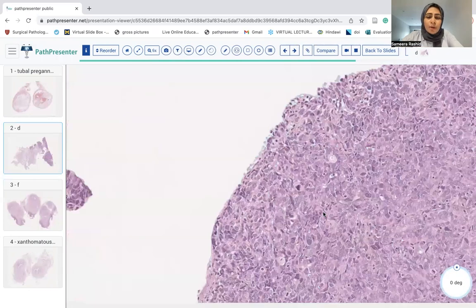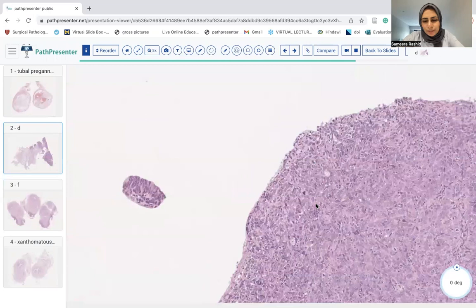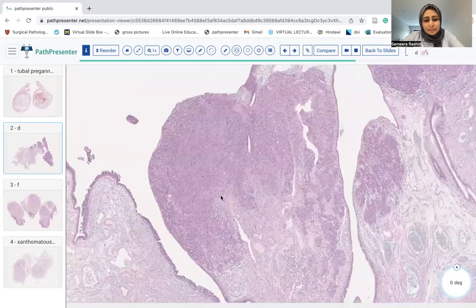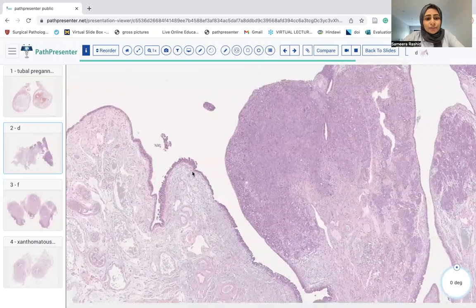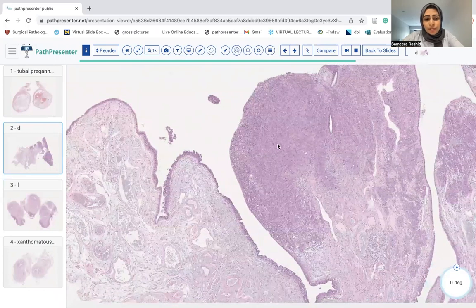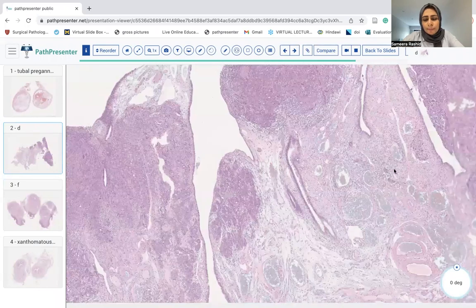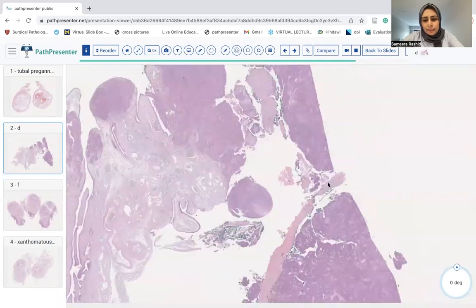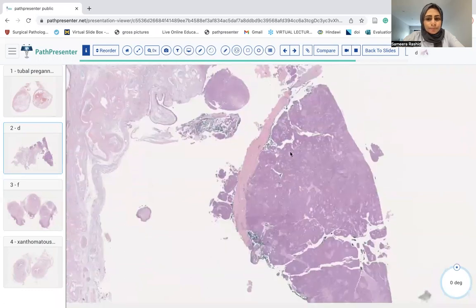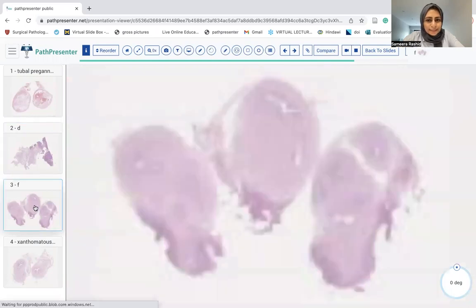So this is a high-grade serous carcinoma arising in serous tubal intraepithelial carcinoma (STIC). It's arising at the fallopian tube lining at the fimbriated end of the fallopian tube and going all the way, making an adnexal lesion. So that was your high-grade serous carcinoma.